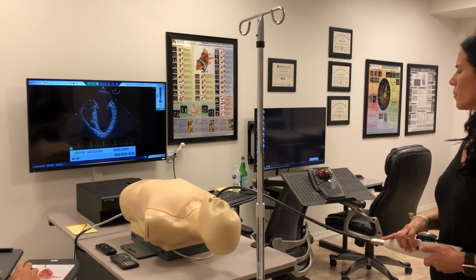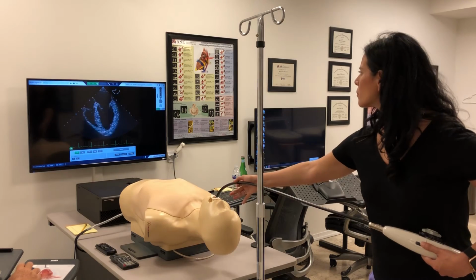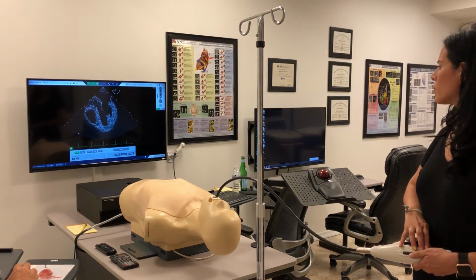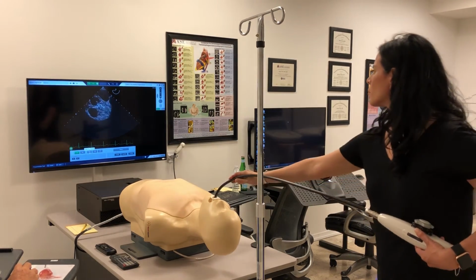Center up the LVOT, or where you're expecting to see the LVOT appear, which is at the crux of the heart. And good. Here is the mid-esophageal five-chamber view. Specifically, we're looking for obstruction in the LVOT.